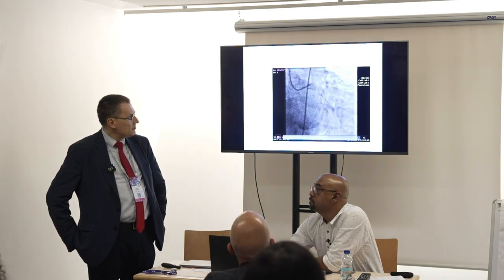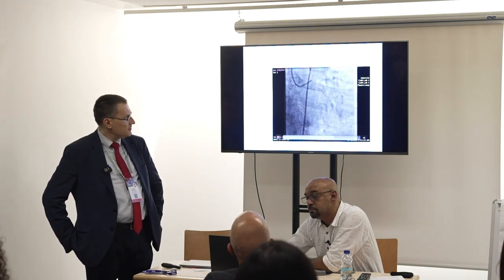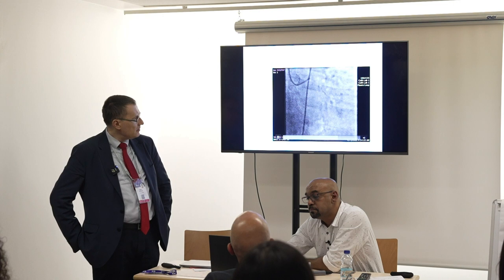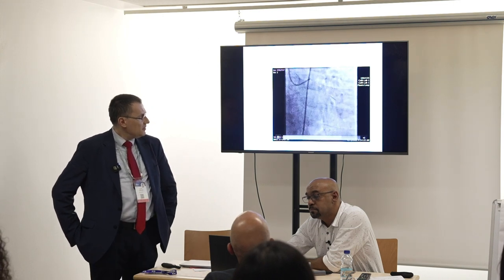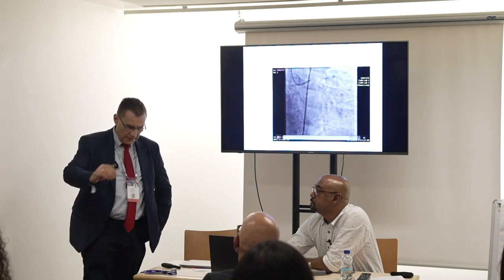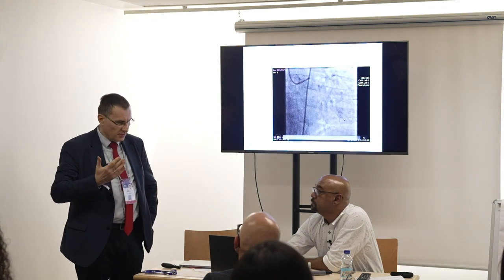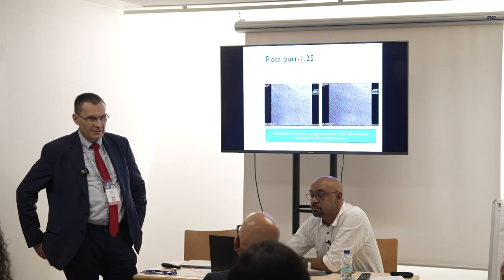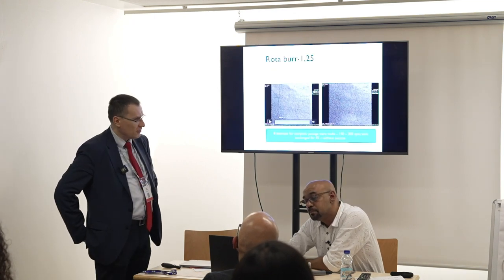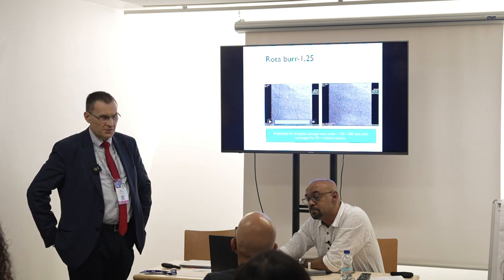Actually, I was able to wire the distal vessel with some manipulation, but fortunately, it was successful. Just to say that this patient was made for me during our training session, live in front of the 50 fellows, on a rotablation course.